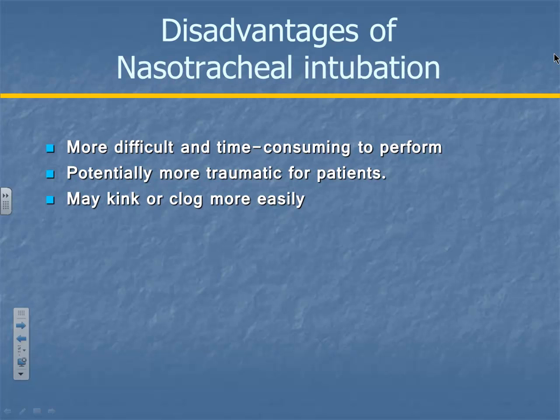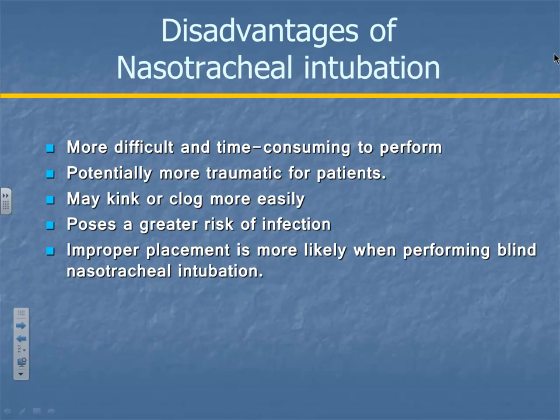It may kink. You know how the nose is shaped. You go up the nose and it goes down like this, and then you've got to get it into the trachea, right? So you've got a really sharp curve going there in order to hit the trachea. So you run a greater risk of compromising that. We said infection.